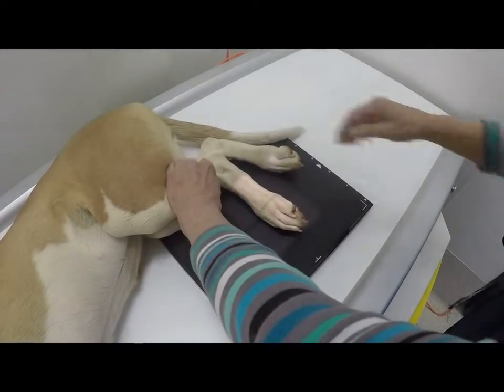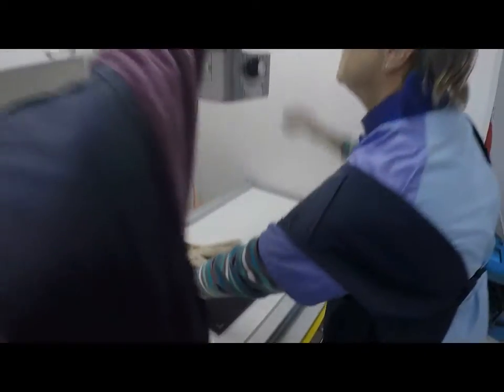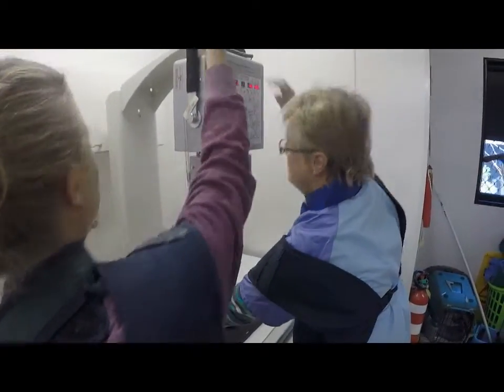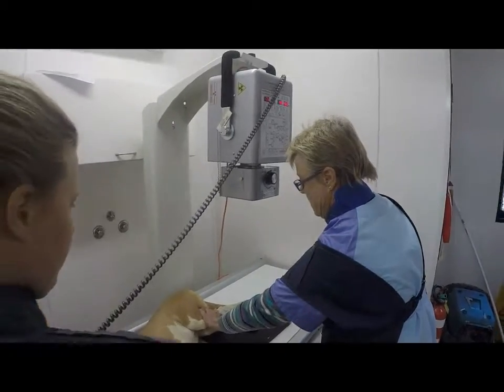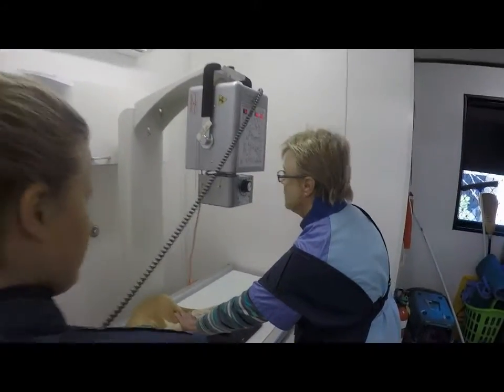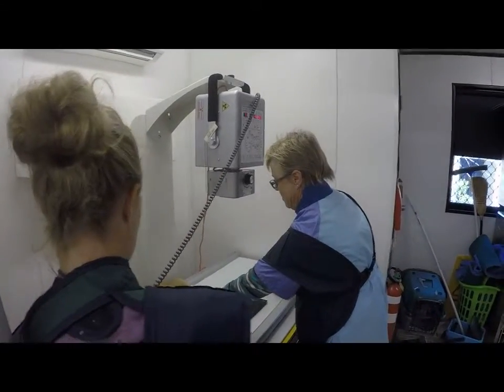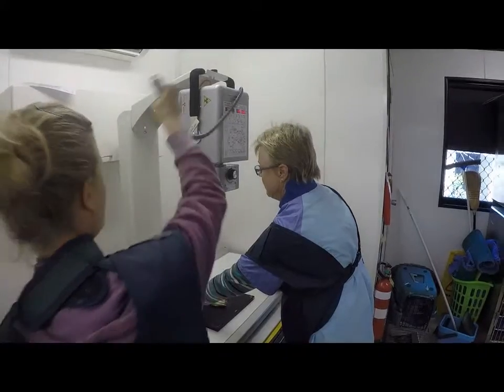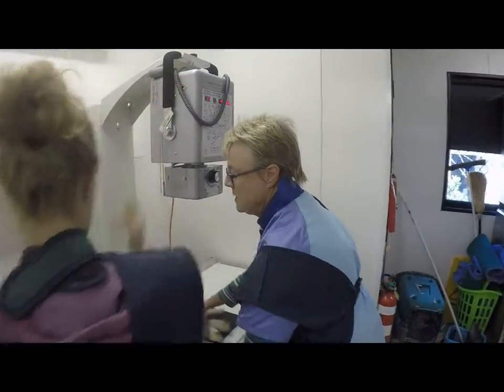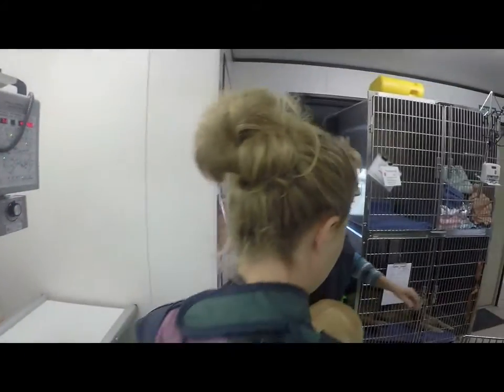So I've got the area focused there of this dog's leg and Sizzle is going to stand from the side and make sure our hands are all gone, and the videotaker is standing behind one of us to protect himself. And when you're ready Sizzle, go. Lovely. So the x-ray's taken and we'll put this dear little dog back in the cage.